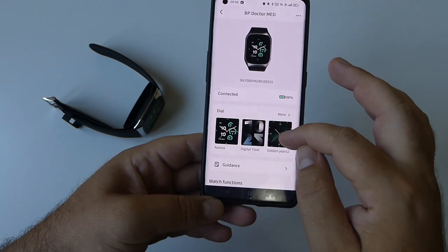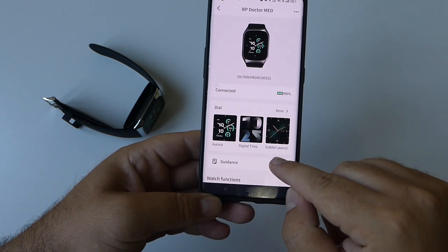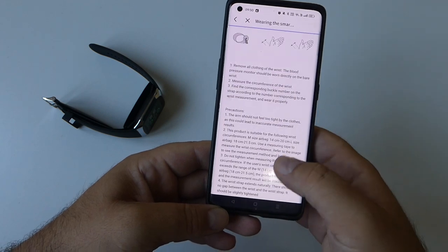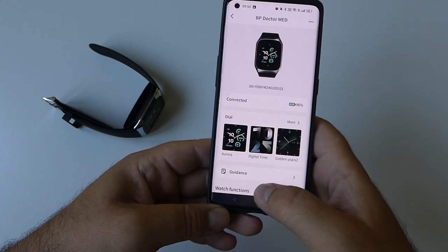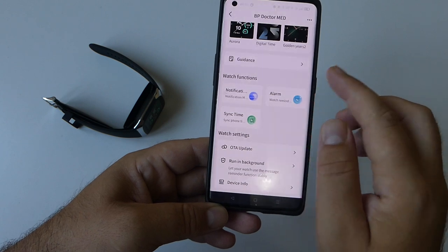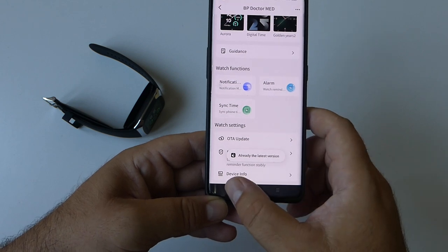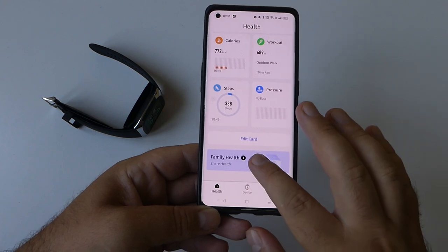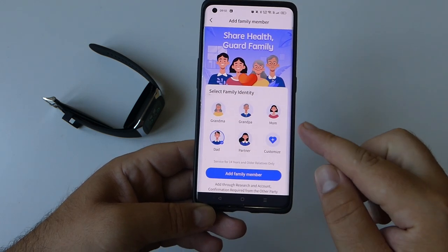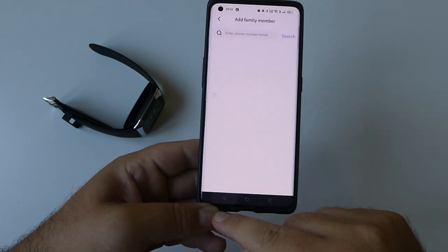In the device section you can change the watch face by selecting your preferred one, and access guidance with useful instructions on how to use the watch and take measurements. You can select notifications for different apps, add an alarm, and check for updates. The BP Doctor app also enables whole-family health management — all synced data can be shared remotely with family members so they can check your physical condition at any time.